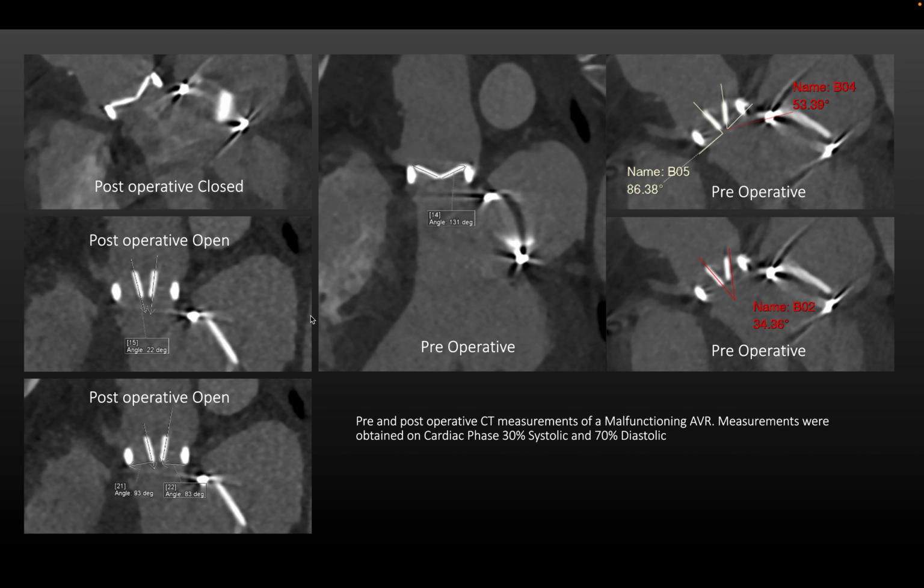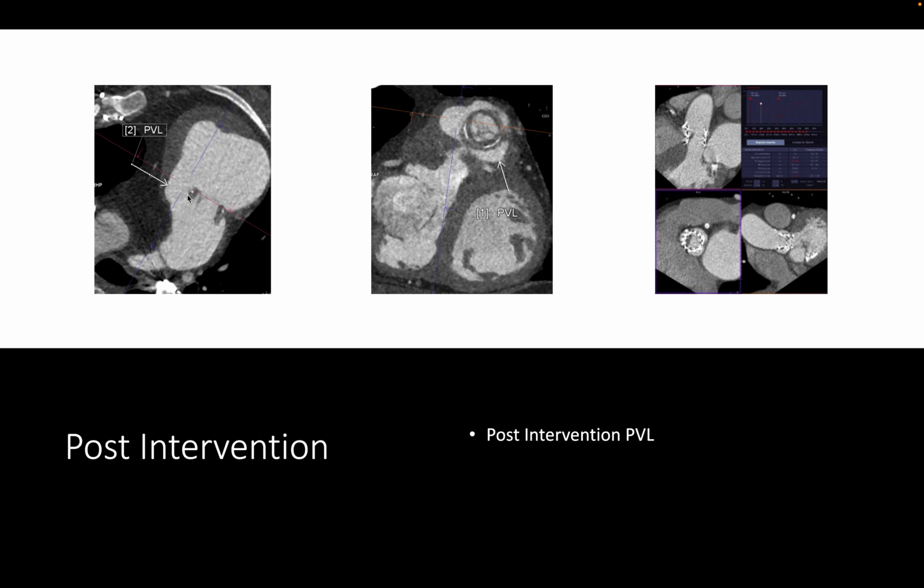So, post-operative complications. Again, after putting the valve, some of those valves might migrate, or might dislodge, providing again another communication between the ventricle and the vessel above, which means there is some sort of regurgitation, which is called paravalvular leak. So it can detect paravalvular leak complications and also describe and measure. So it could guide later on whether that could be closed surgically or percutaneously.